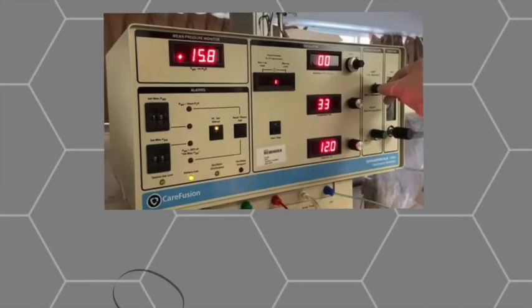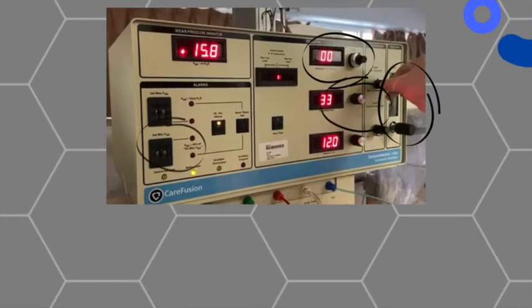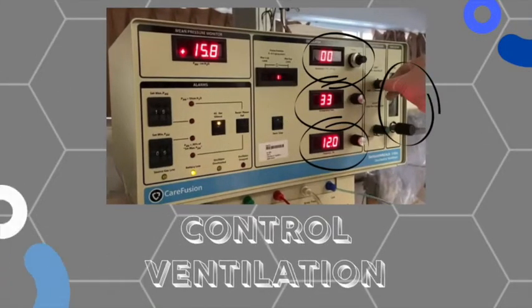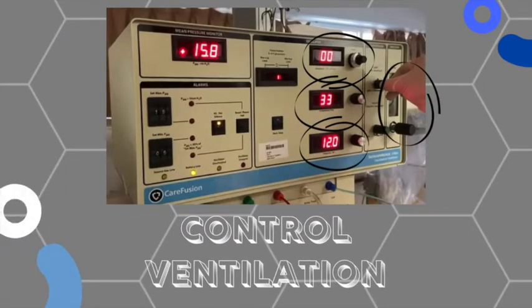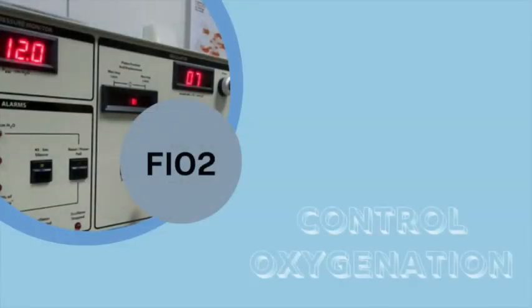Could you please tell me how to control the ventilation? You can control the ventilation by adjusting the amplitude, frequency, inspiratory time, and the bias flow, which have the most impact on ventilation during high frequency oscillatory ventilation. What about the oxygenation? You can control the oxygenation by adjusting the mean airway pressure and FiO2.